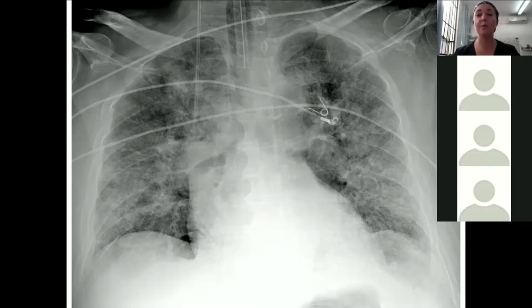If that doesn't work, we would try non-invasive ventilation or high flow nasal oxygen. So you need a ventilator to do that, but the oxygen that you're supplying sits on their face, not through an ET tube that you've intubated them. And they tend to do better with that than intubation. So it's an interesting one in terms of what we would do that's very different to what we would normally be doing. Okay. So this patient, typical COVID x-ray, we're seeing a lot of these type of cases in the ED.